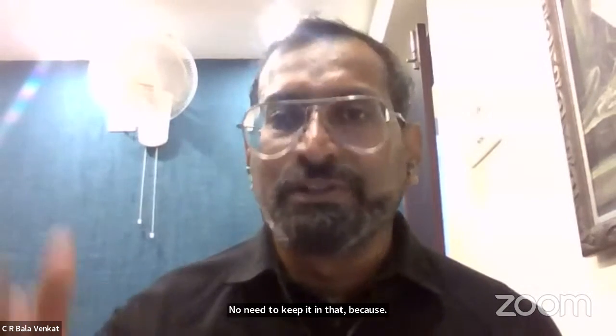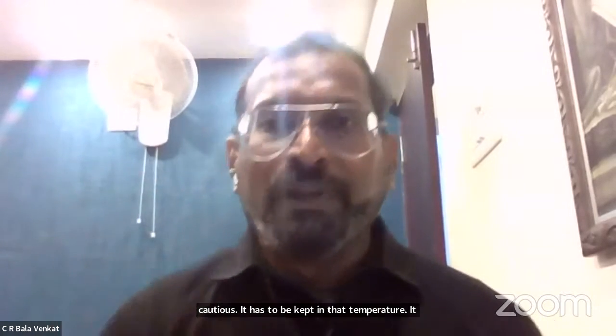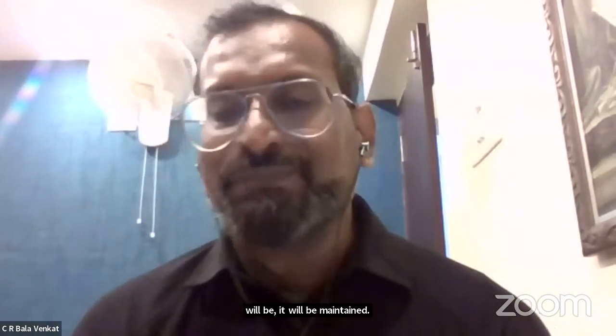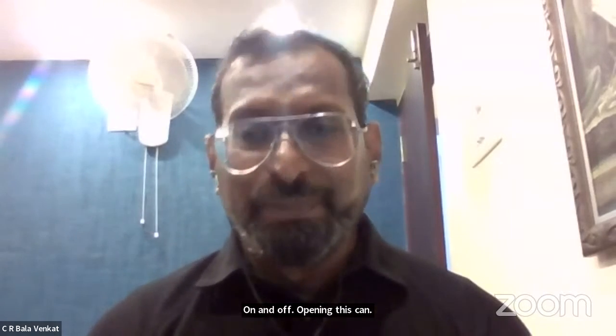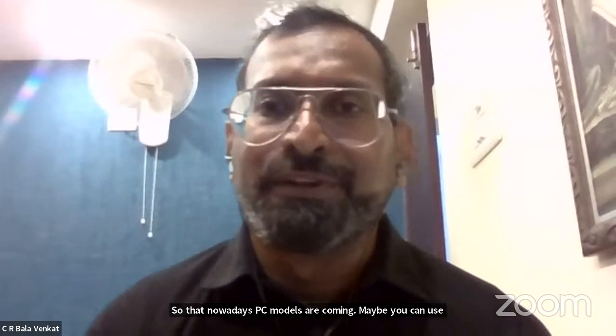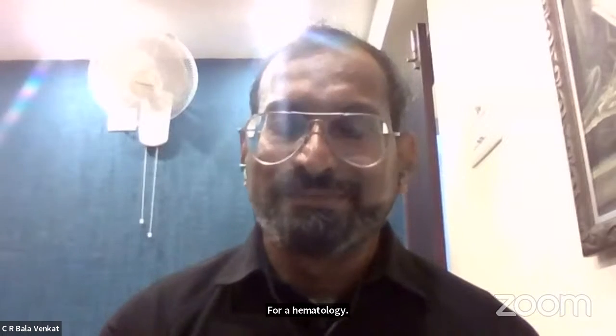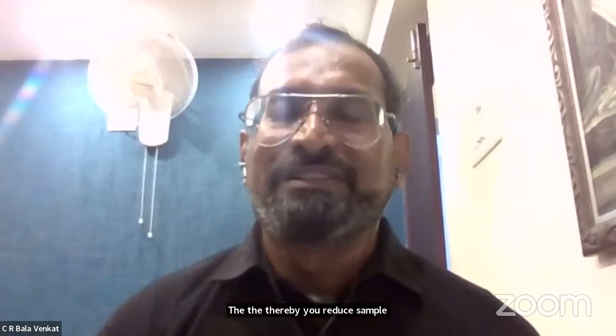So you have to be very cautious. It has to be kept in that temperature. It will be maintained. On and off opening can be avoided, so nowadays piercing models are coming. Maybe you can use the piercing model for hematology, thereby you reduce sample handling. So that is the reason we go for piercing models.